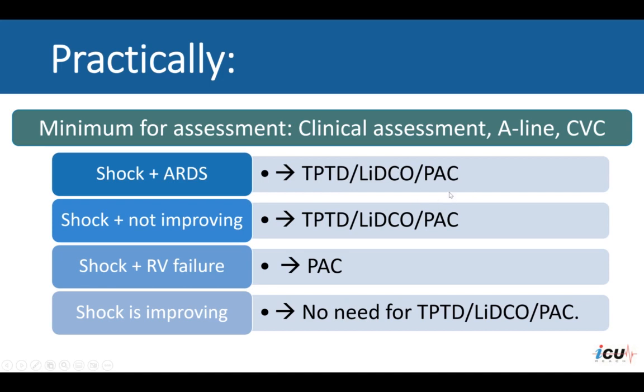We rarely do that now for those indications, since we get enough information that we need from either the TPTD or the LiDCO devices. Also, those patients who are in shock and you initiated management, resuscitation with fluid and vasopressors, and are not improving, you may get more information through these devices where you can alter your management of these patients.